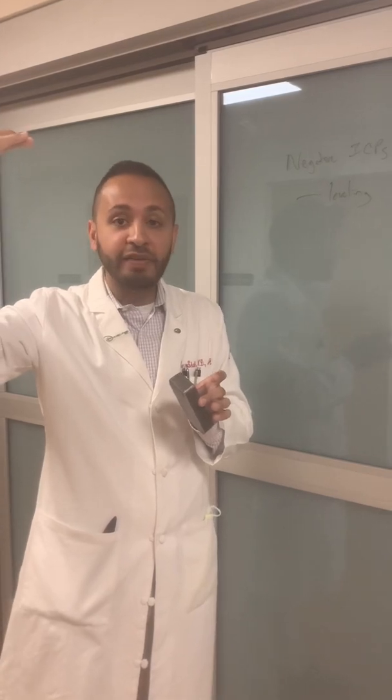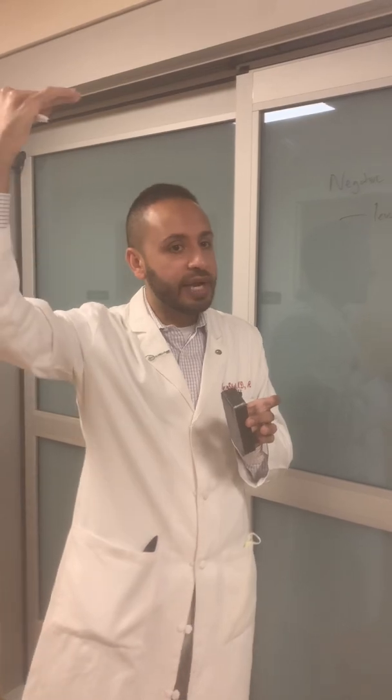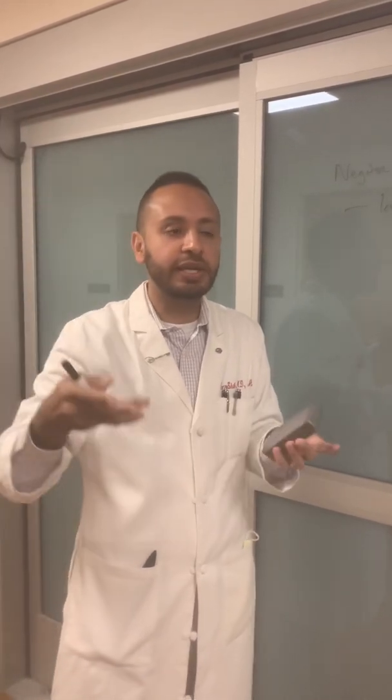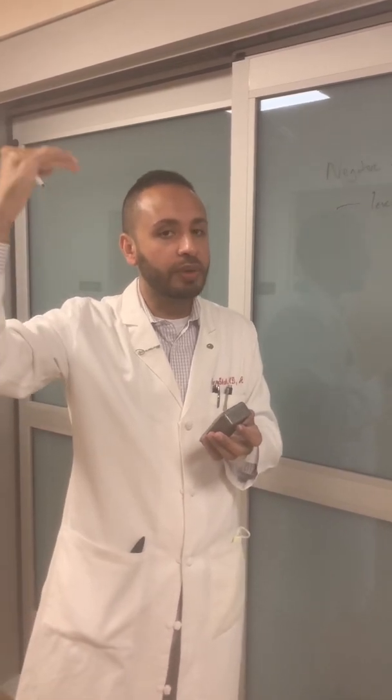At that point, you're going to have an abnormally low ICP. So it's probably going to be negative at that point, right? Because the baseline ICP is already pretty low, right? 2 or 3 or whatever. So you raise that up, your number on the screen is going to be negative. Now, if it's 19 or 20 normal ICP, then perhaps the number you're going to get is like 15 or something, depending on how far you go up, right? But that's an easy case scenario where you have a very low ICP patient, 2 or 3s, and then it's not leveled properly, and because it's higher than the foramen of Monro, you're going to get a negative ICP. All right, so one is leveling.